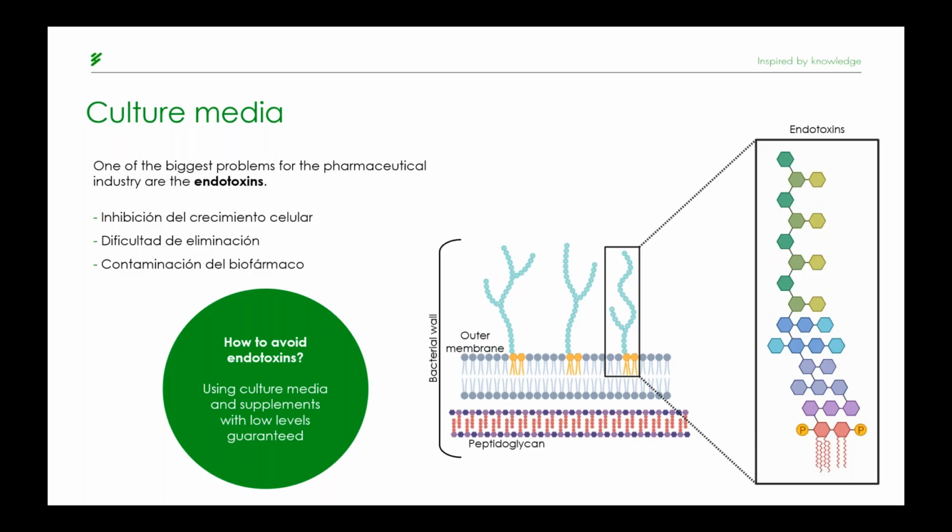So usually what companies use to eliminate the endotoxin from the material, from flasks or other lab material, is the depyrogenation process, which is more than 1 hour at 200 Celsius degrees. In Fahrenheit, it is 400 Fahrenheit degrees.